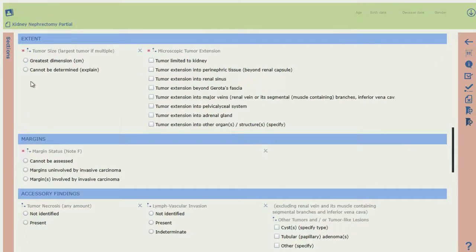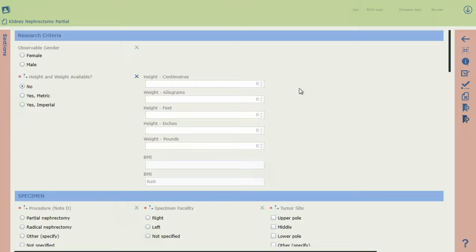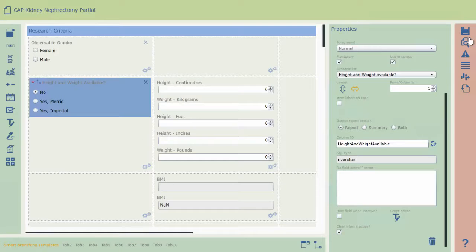When previewing the template, you'll notice there are fewer questions than there are in the Designer surface. This is due to Synoptec's responsive templates. Follow-up fields only appear when the responsive template knows that they're relevant. Let's add our own smart field so we can capture additional details without cluttering up our report with irrelevant questions.